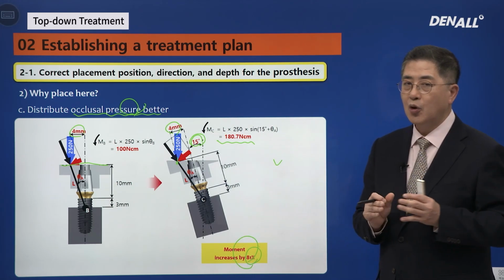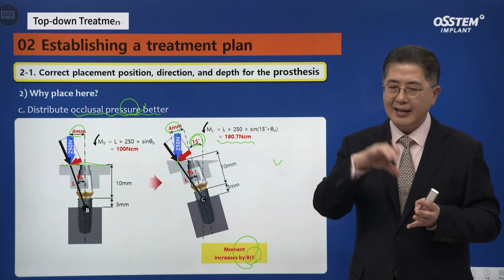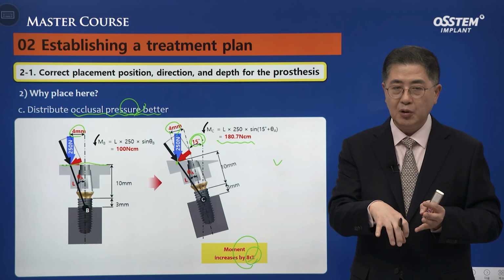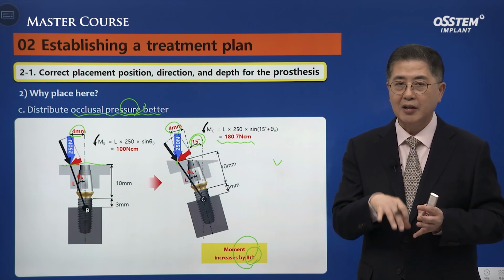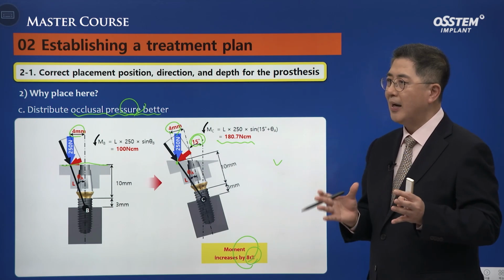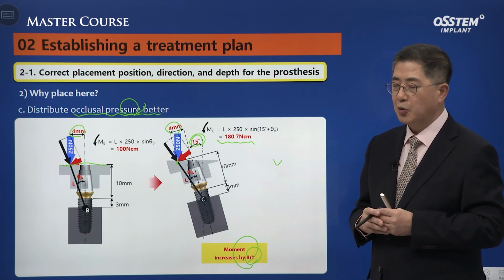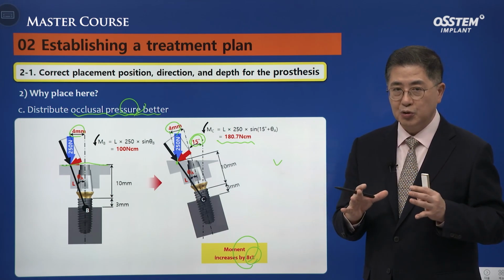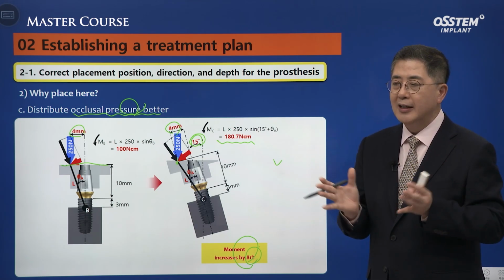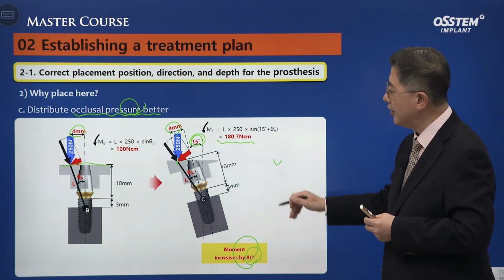Hence, compared to natural tooth, the occlusal table of the implant should be more flat, and we need to make sure the occlusal force is towards the central fossa. Mimicking the natural tooth is the goal of implant treatment, but personally I think the occlusal table needs to be reduced and cusp angle needs to be about 5 to 10 degrees less than natural tooth, considering such mechanical factors.